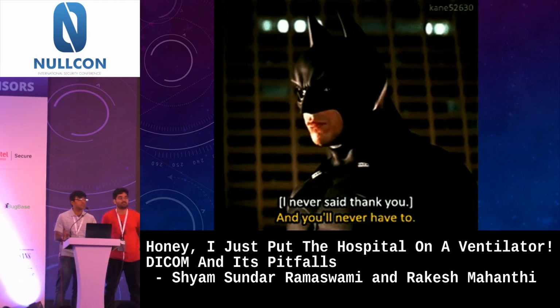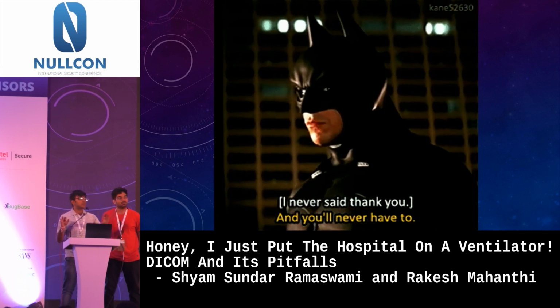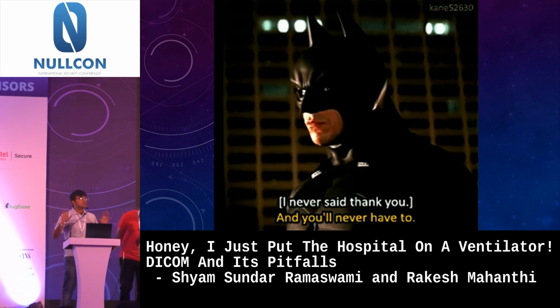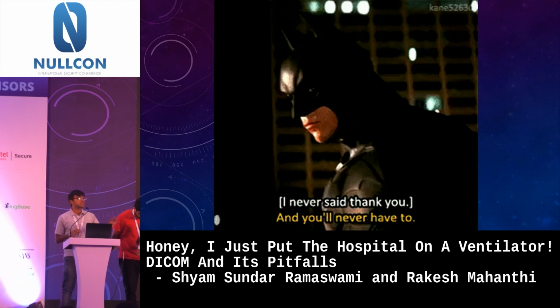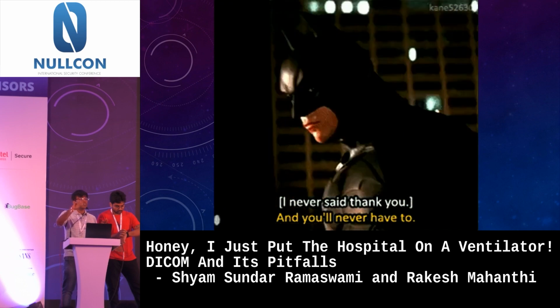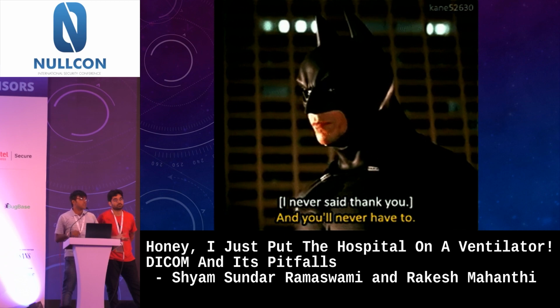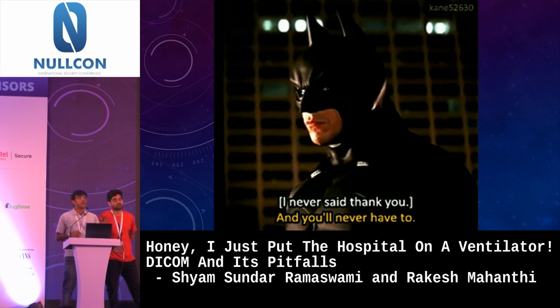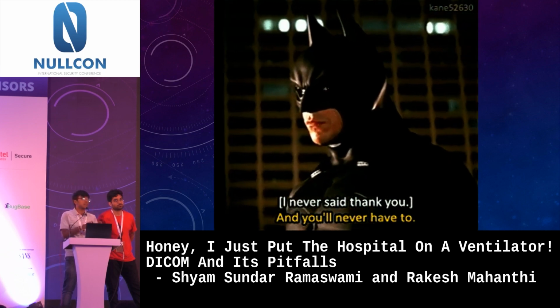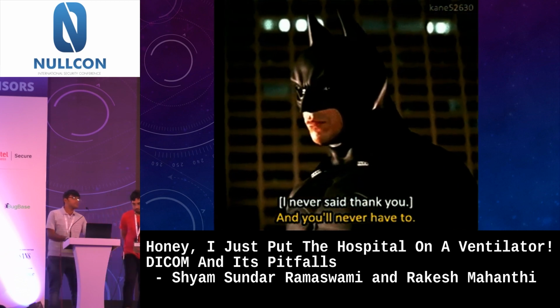Just one more thing I wanted to add: whoever is from the healthcare industry knows what QIDO, WADO, and STOW protocols are, right? One thing to note is that C-STORE and C-MOVE usually won't transfer the preamble section of the DICOM file. Those protocols are used only to transfer data from device to device. But web-based PACS use QIDO, WADO, and STOW. These protocols will transfer the preamble section of the file as well, so they are indeed vulnerable to the attack we've just shown you.